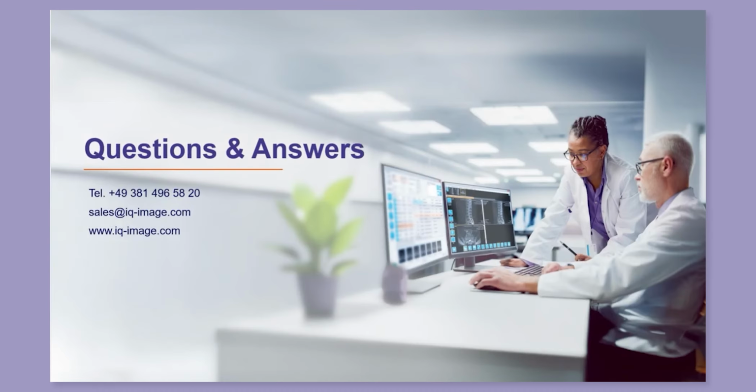iQ-DOSE 2.0, built for real workflows. Ready for the future of dose management.